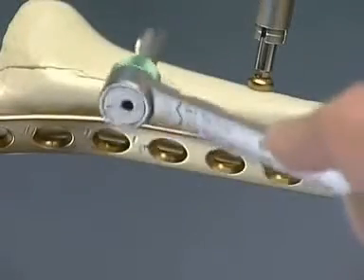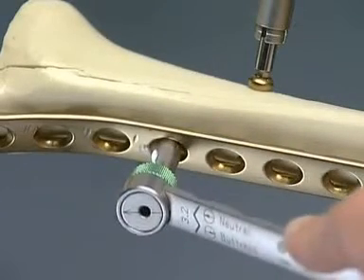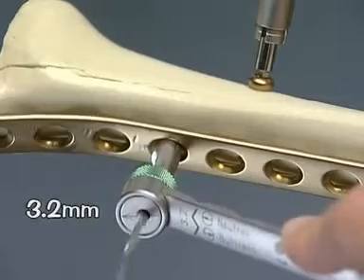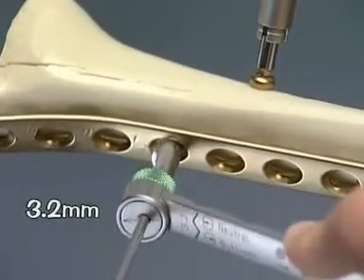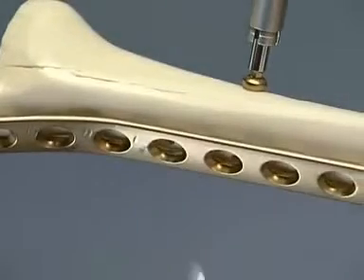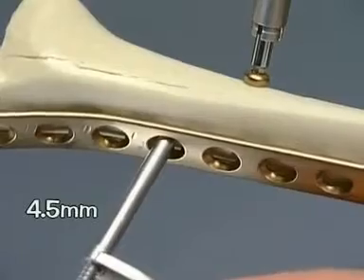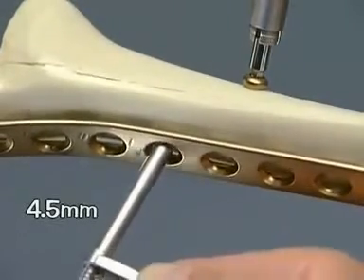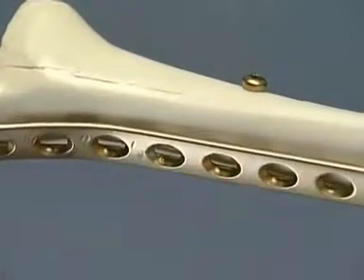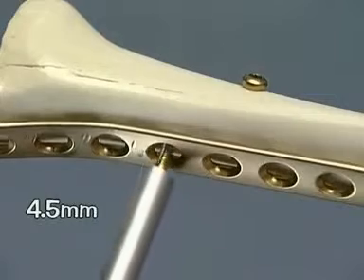A short 4.5 millimeter cortex screw is inserted neutrally through the middle hole of the plate. Drill a hole in the proximal cortex with the 3.2 millimeter drill bit. Tap with the 4.5 millimeter tap. And insert a 16 millimeter long screw for the preliminary fixation of the plate.